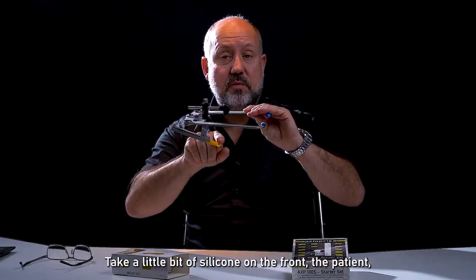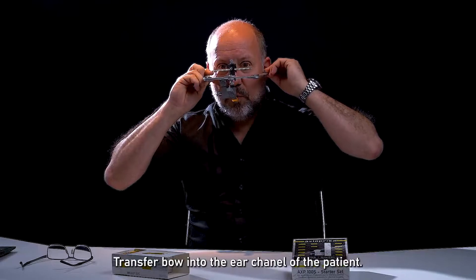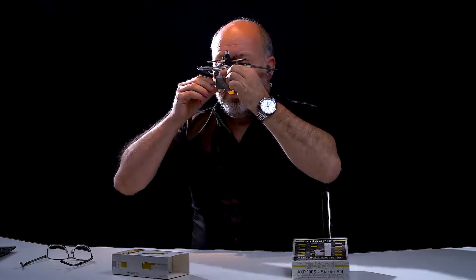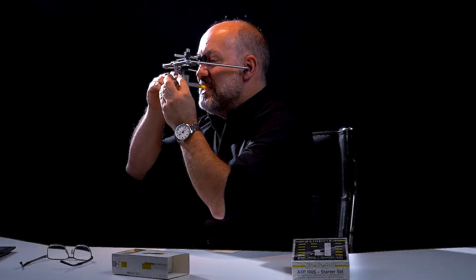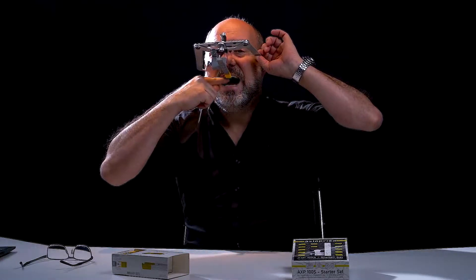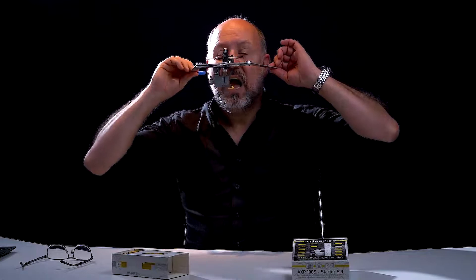Take a little bit of silicone in the front of the patient. Transfer bow into the ear channel of the patient. Fix the nose. Put silicone on the bite fork. Attach. Let the patient bite. Fixed. Scan. Fixed. Remove.